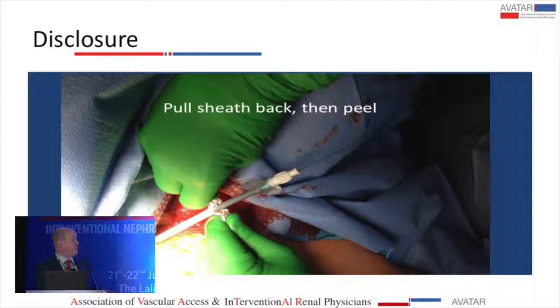And on the last case also, you see that the graft isn't coming up here, it's going way up over the top of the shoulder. Even then it's going to clot. As you saw, 22% primary patency. So you may consider an antiplatelet or anticoagulation. There's no evidence for this. There are only small series reported, and there's nothing to guide you.